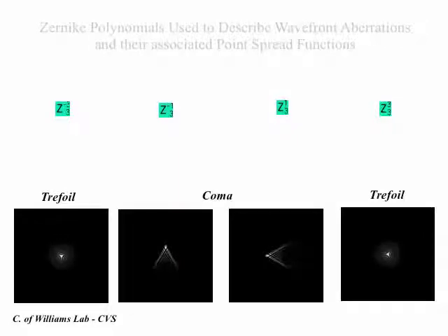In the same way that we didn't use just the raw Placido disk images, that we used the color-coded maps, we need to find some way to display the wavefront data, to go from the array of little tiny dots to something that is usable clinically. And there are two ways of doing this.